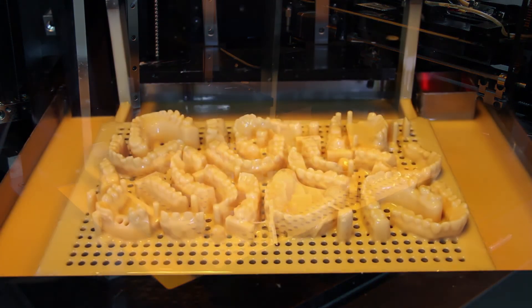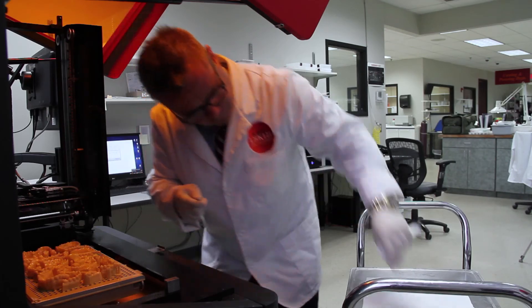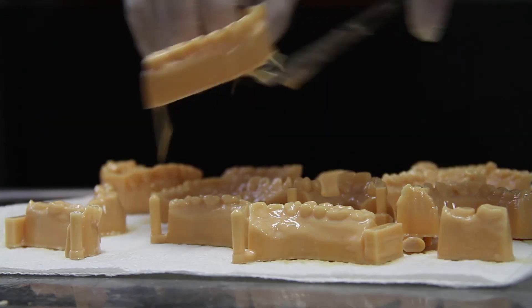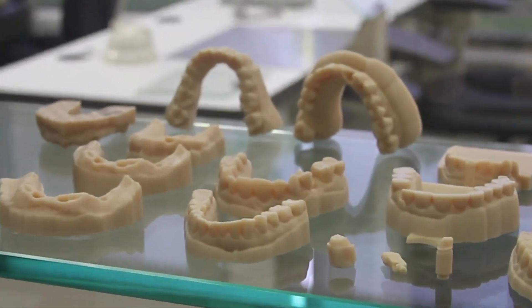Just like a traditional stone model, all of them have to be exactly the same — but with a printed digital model, they are the same. We can turn the resolution on our Vector up to where we can maximize our use of e-models, surface texture, and accuracy.